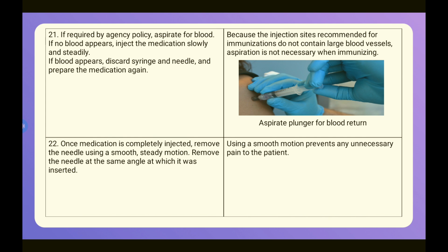Number 22. Once the medication is completely injected, remove the needle using a smooth, steady motion. Remove the needle at the same angle at which it was inserted. Using a smooth motion prevents any unnecessary pain to the patient.